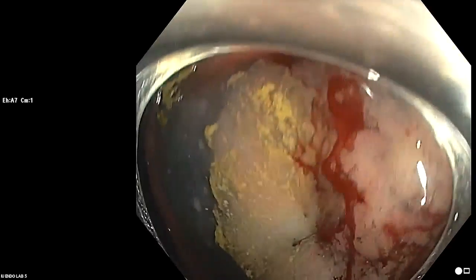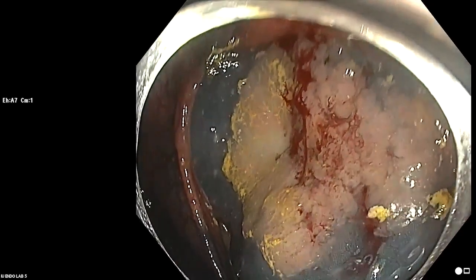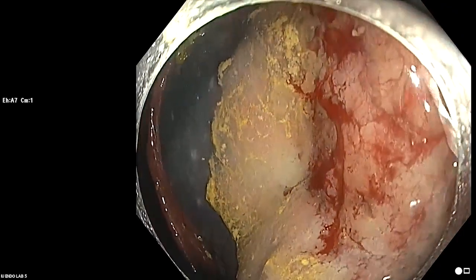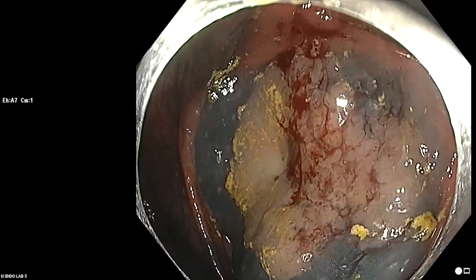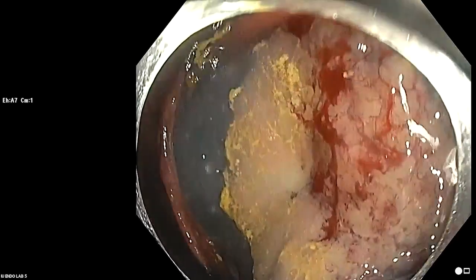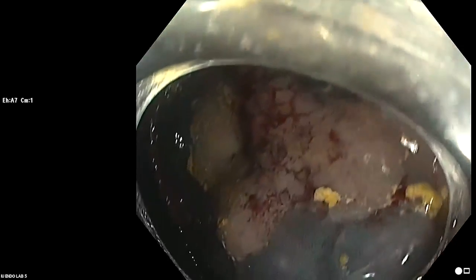So I do think there's a little bit of an issue with this not lifting very well in the middle. And that's probably from the biopsies, those little divots that were taken. Could somebody look up the date that the referring doctor did the colonoscopy for me? We'll try to see how old those little divots are. Any comments about cold resection? Would everybody do this cold?